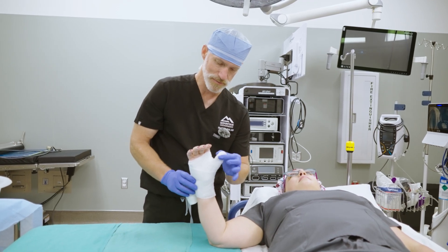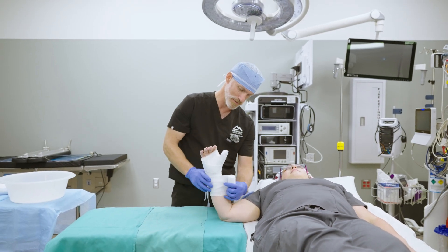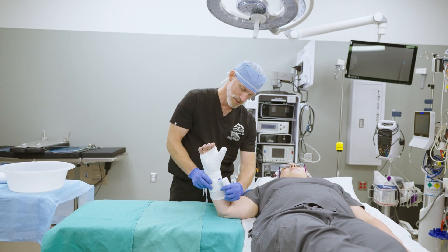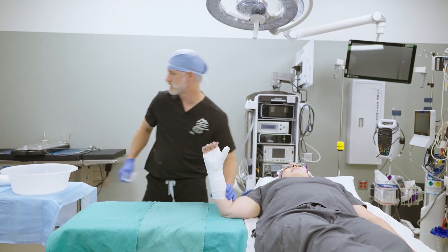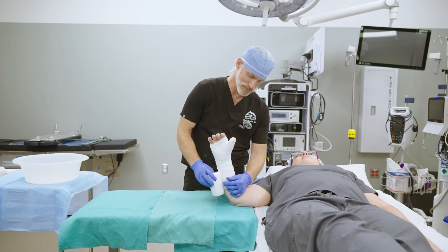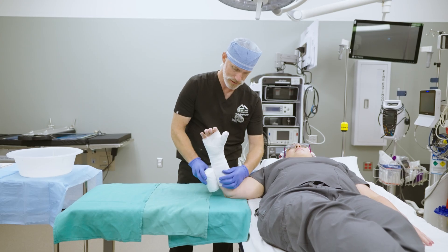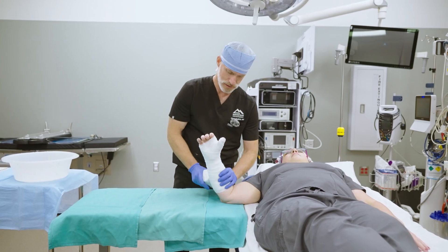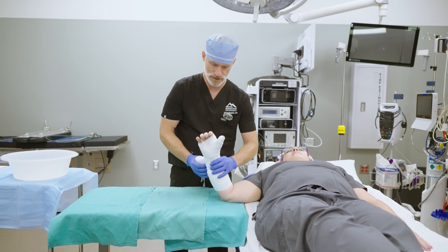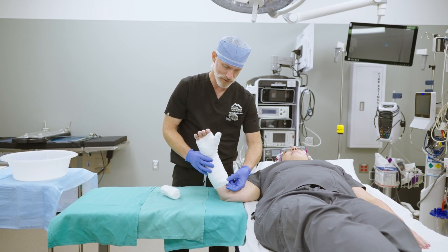So we've got three loops around the thumb and three loops around the hand. I'm going to get three layers around the rest of this, coming down overlapping by thirds. As I get to the top of the splint, I like to make sure I have three layers right on top of each other — one, two, three — so there's a nice solid edge to the top and it doesn't have padding hanging out. It's nice and thick right here, three layers thick.